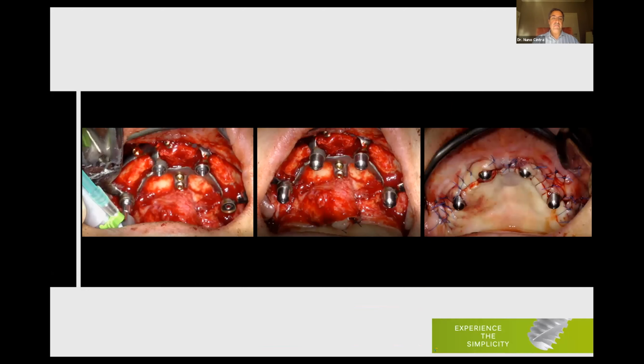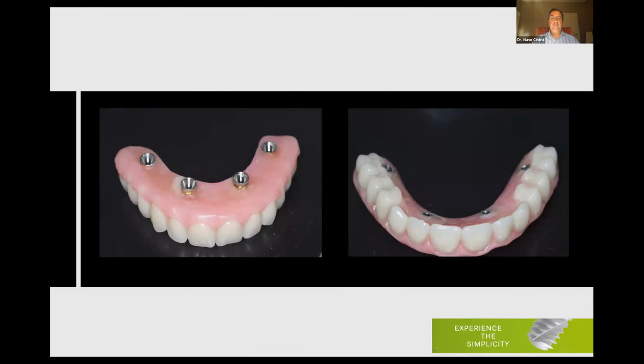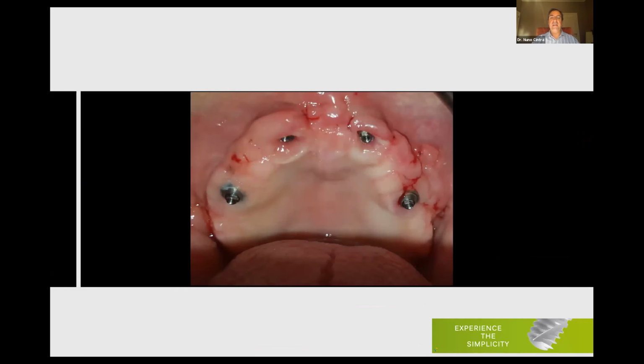So after we place the implant, after we screw the implant, we place the abutments, like the multi-unit abutments in a normal all-on-4 case, caps, and we close. And this is the post-op X-ray. Immediate provisional bridge, and 10 days after surgery, you can see a very good keratinized tissue around the abutments. So it's a good solution for very atrophic cases.